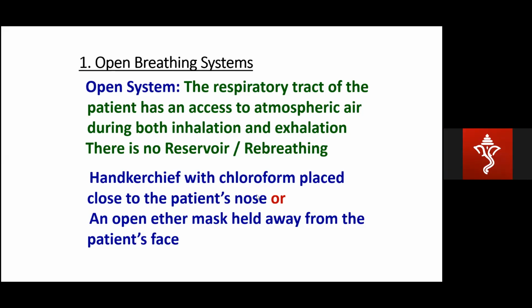Madam, very well. Okay. See, first we'll talk about classification of breathing systems. Breathing systems are classified into open breathing system, semi-open, semi-closed, and closed. So let us see what this open and closed means.